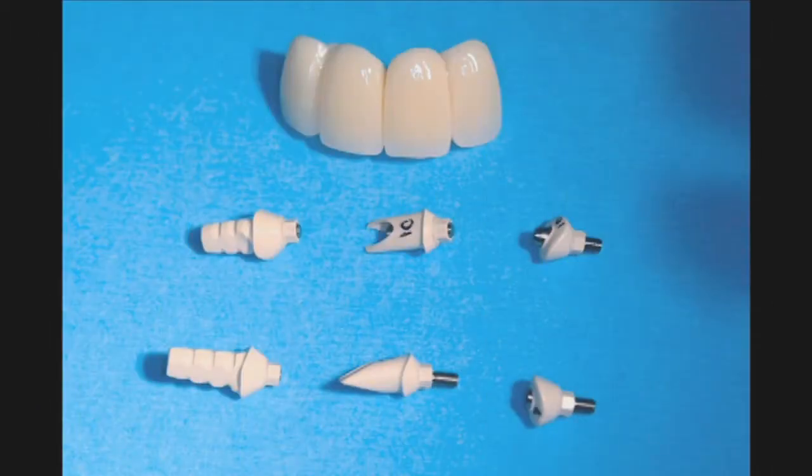This is what is very unique about the inclusive tooth replacement solution. Glidewell Lab provides a custom healing abutment, approximating ideal tissue contours, which again were predetermined using the CT scanning software, transitional custom milled abutments used if the implants are torqued to a minimum of 35 Newton centimeters, which they were here, and custom milled impression copings that will be used after integration and tissue healing.